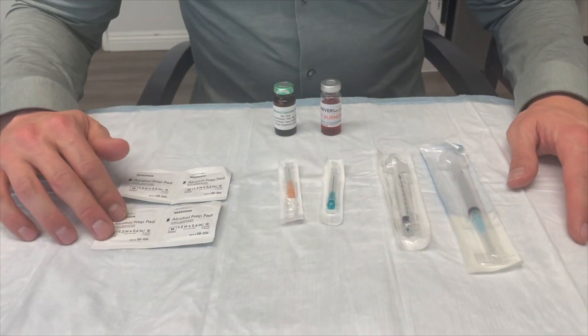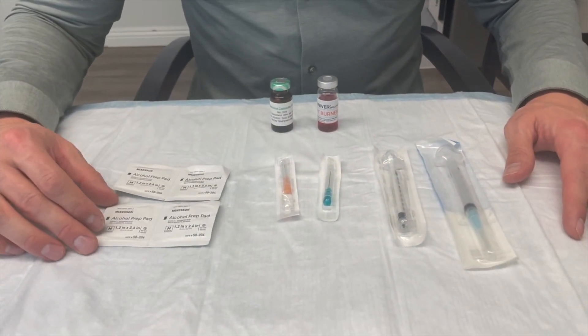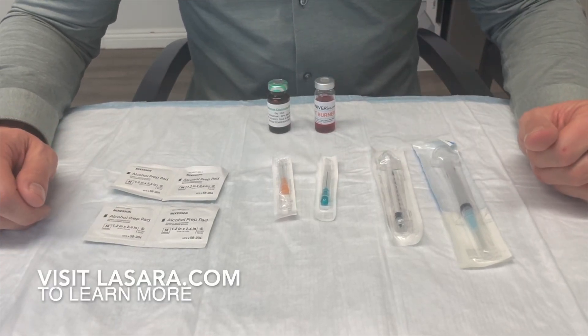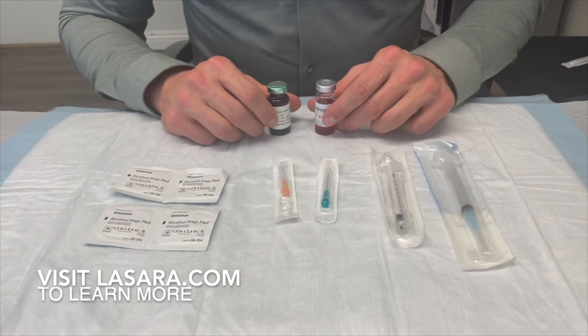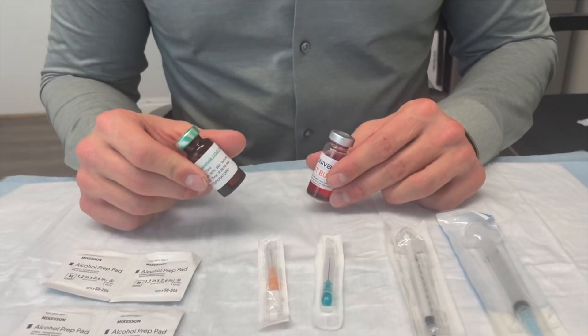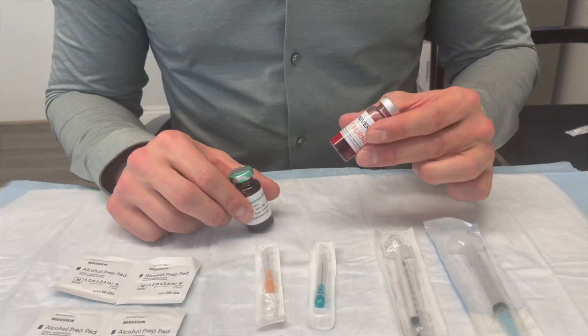Next we have our prep pads. Alcohol prep pads are used for cleaning off the top of the vial as well as cleaning off the injection site. And then depending upon what you're coming to us for, you're going to have a vial of either testosterone or a vial of a peptide.